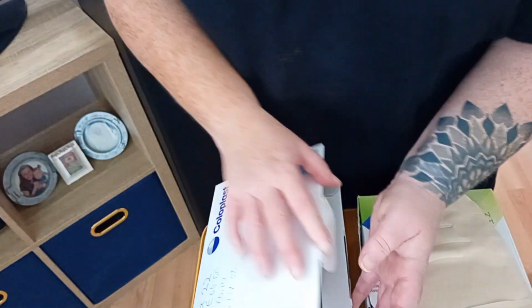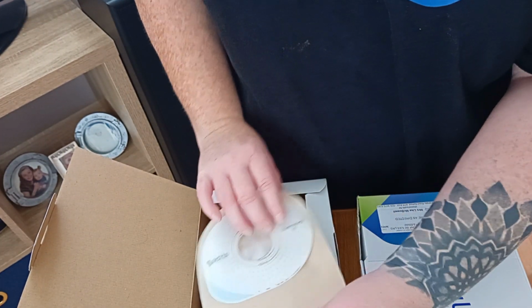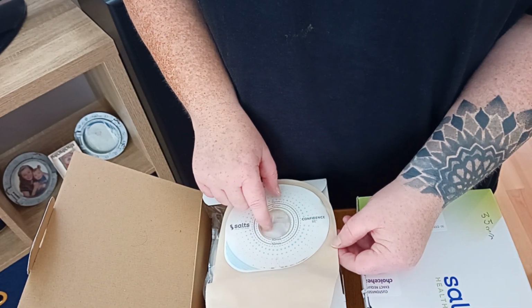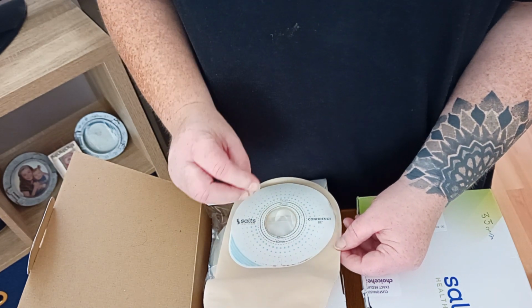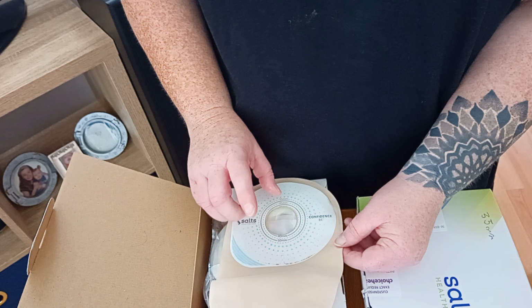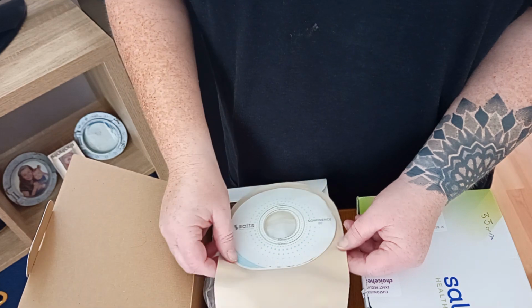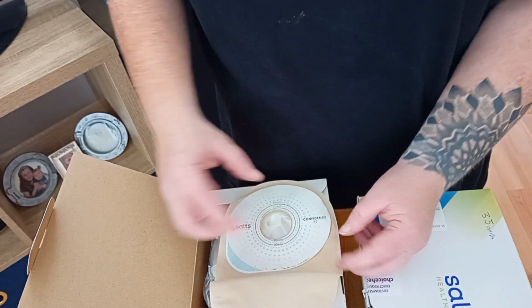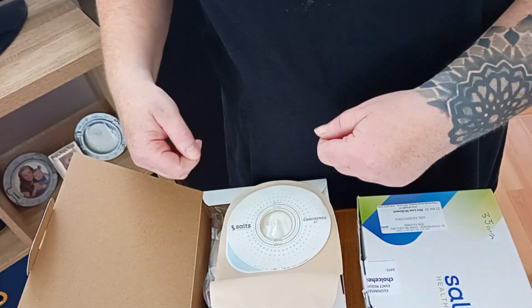So this is my bag. Obviously, it's really, really good. I love it. When I first started out, it started off at 35, I think. I'm down to 32, but it makes a difference, because the circumference of the circle has gone down a good bit. But my stoma hasn't actually. It's still a sort of biggish stoma. But you get them cut to the size you need, and you get a wee piece of card or paper with the size on them, so you can get the perfect size.